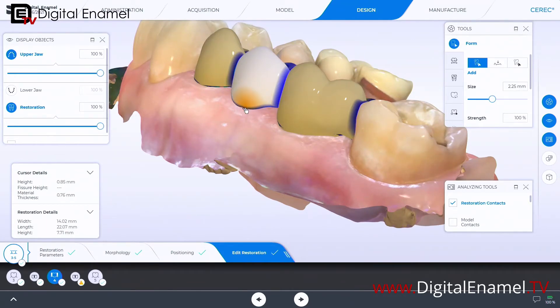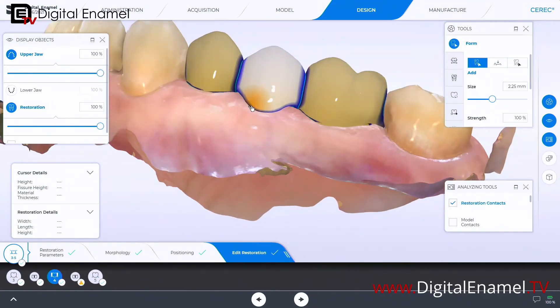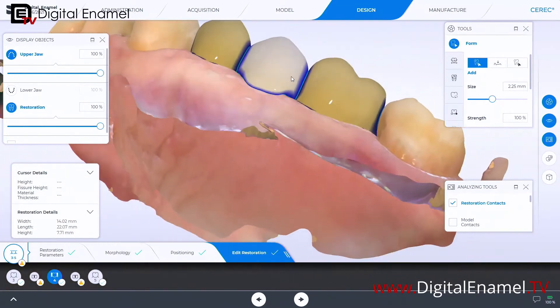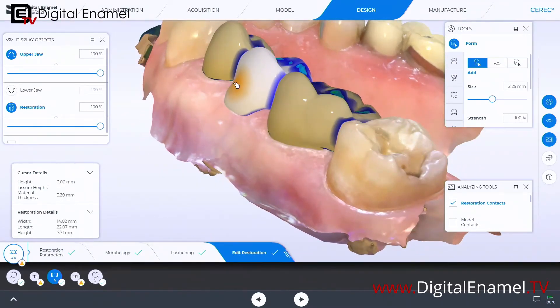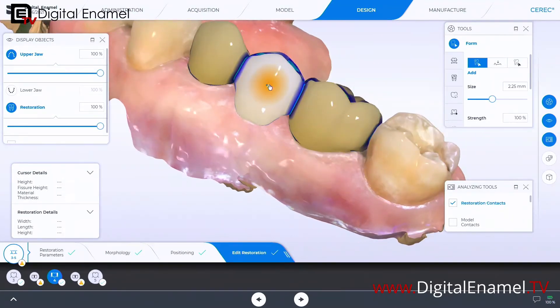The two options are to use the two-directional circular shape tool or the add tool. I'm going to start pulling this up — I'm not worried that it's going through the tissue yet, I'm going to get some bulk to this first. I want to thicken this up on the buccal surface as well and give it a little bit of contour.